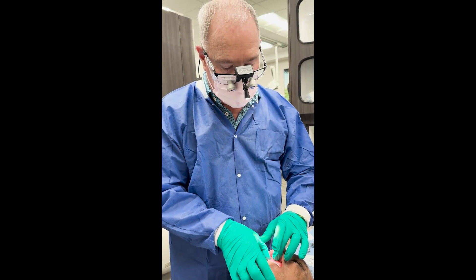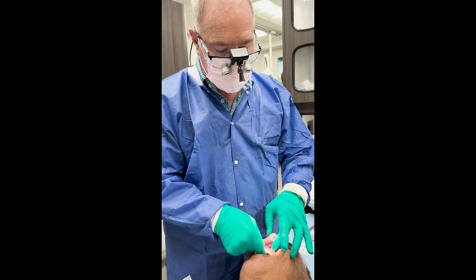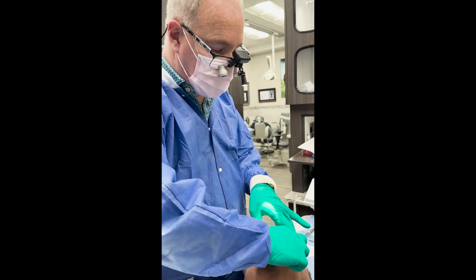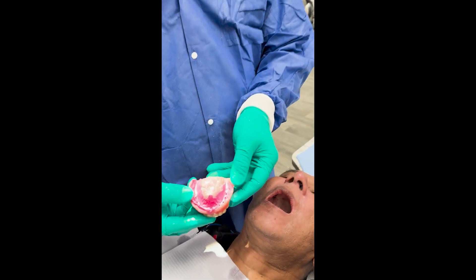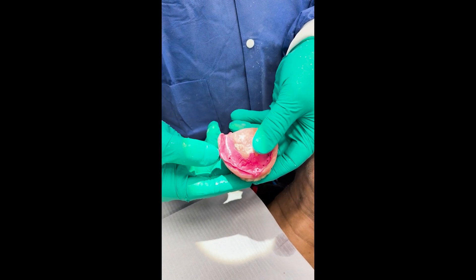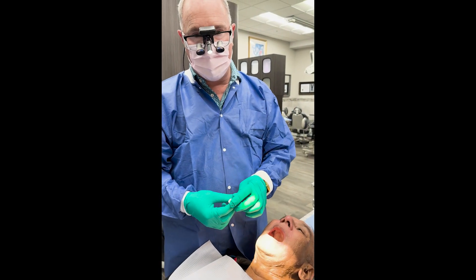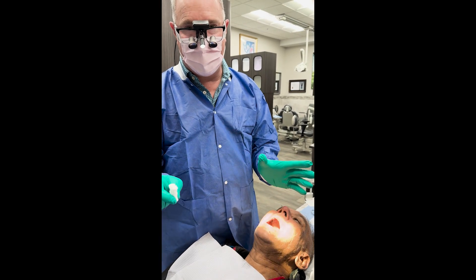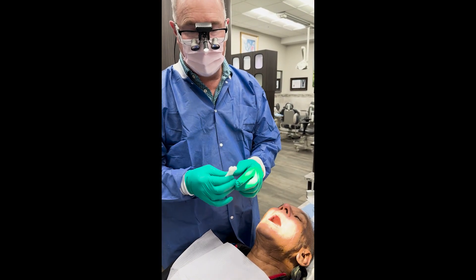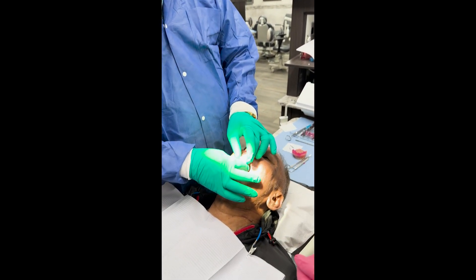This is already set. I'm going to take this out. It gets very hard and it's not always easy to get out, but it's nice and set — that's just temporary. So this is my two cotton roll bite — it's really not patented, but this is how I do it when I don't have a bite rim.